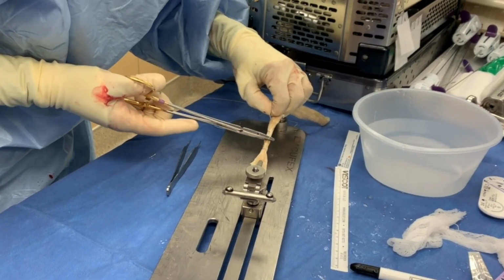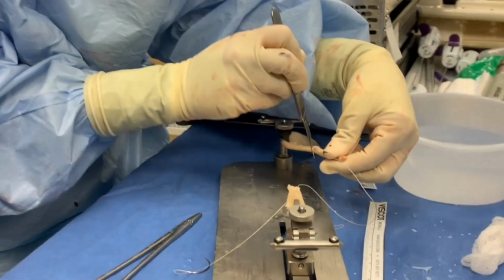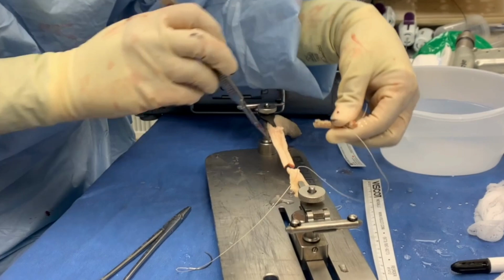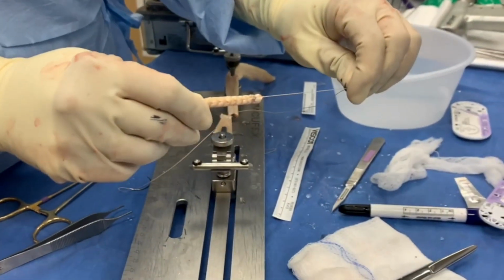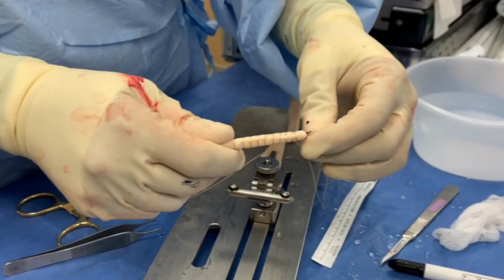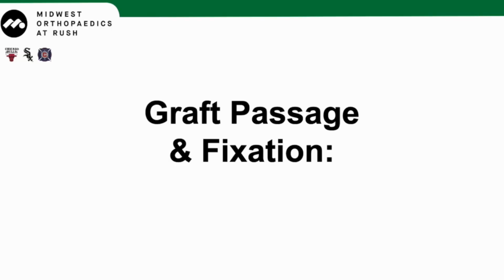The prepared central portion of the allograft was then sharply divided from the rest of the graft using a scalpel, and the ends were ensured to be satisfactorily tapered for subsequent passing. From the two sliding suture tails from the anterior and posterior anchors, one of each is brought out through a cannulated distal anterolateral accessory portal and passed through the graft using a free needle. The other end of each suture is pulled through the anterolateral portal, which is then used as a viewing portal.